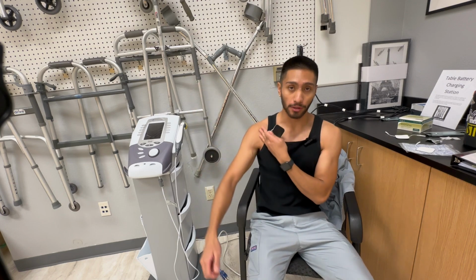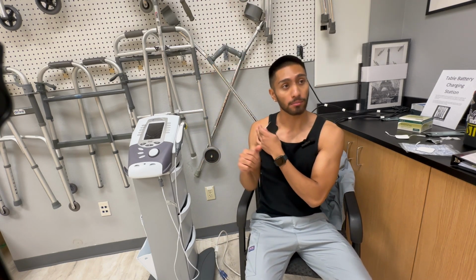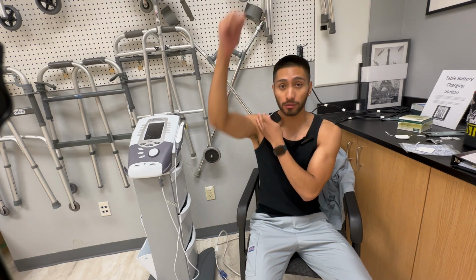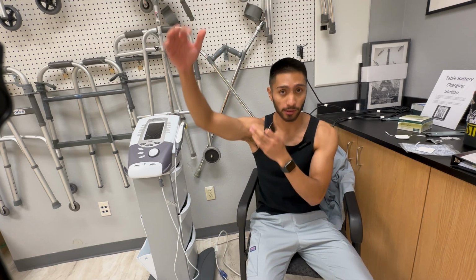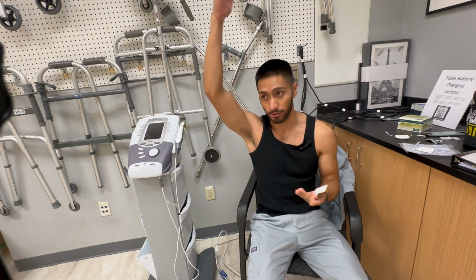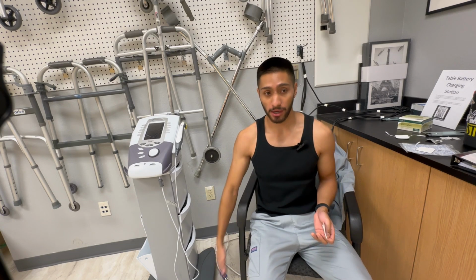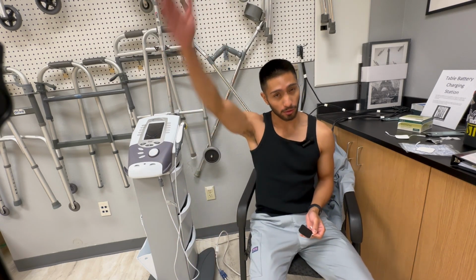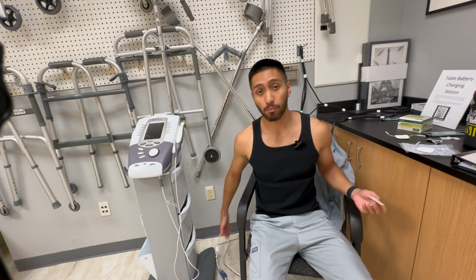Moving through shoulder flexion, shoulder extension, with some shoulder abduction going on, I do already feel an immediate sense of relief where there's not too much shooting pain, like a stabbing sharp pain. I wouldn't say it feels normal, but it definitely feels like pain reduction, where I can move my arm around without too much pain compared to prior to the treatment.